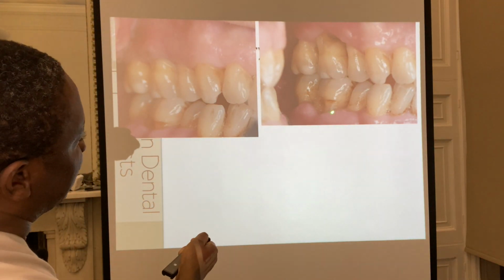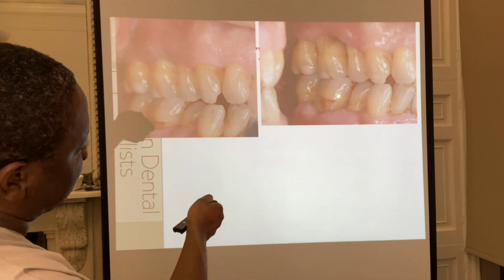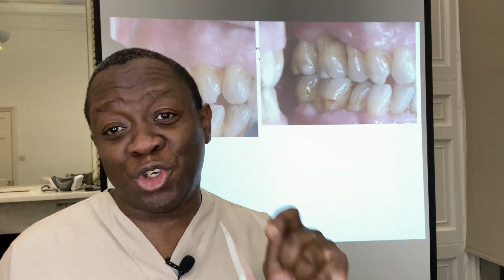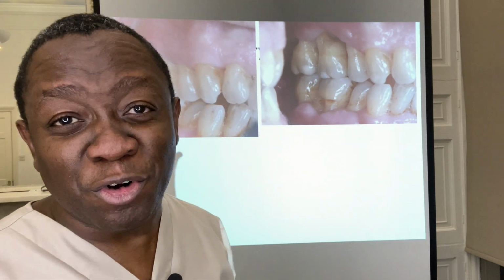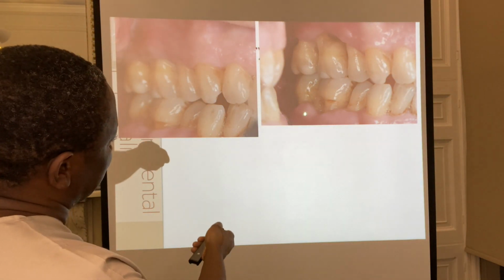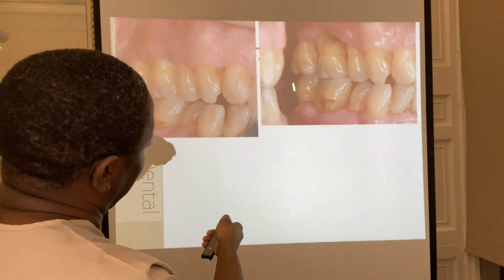On the lower right side, I was able to expose what is called a furcation, and once you can expose that area and show a patient how to clean into it, the prognosis of the tooth increases dramatically. But I wasn't able to do that predictably on this last tooth on the lower right. So what I also did was remove one of those roots. And you might be thinking to yourself, if he removes the root, is the tooth going to fall out? No. There was no difference in the looseness of the tooth before and after treatment. In fact, they were not loose.